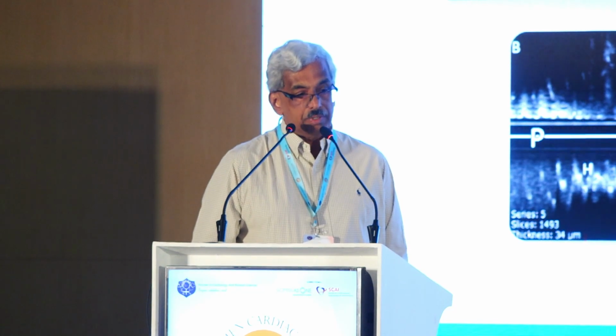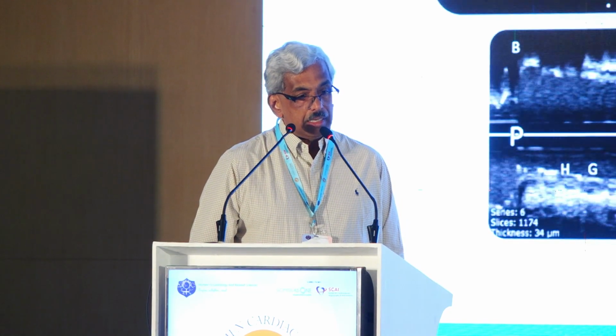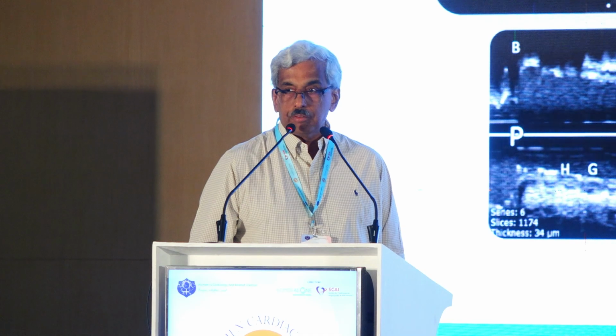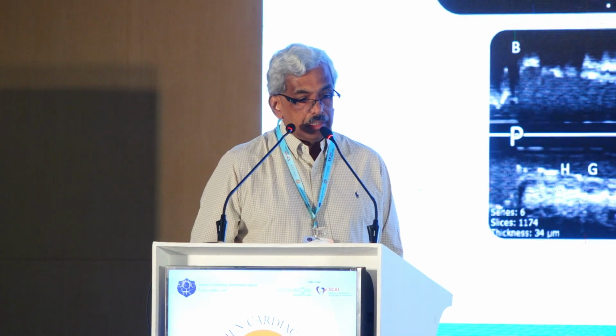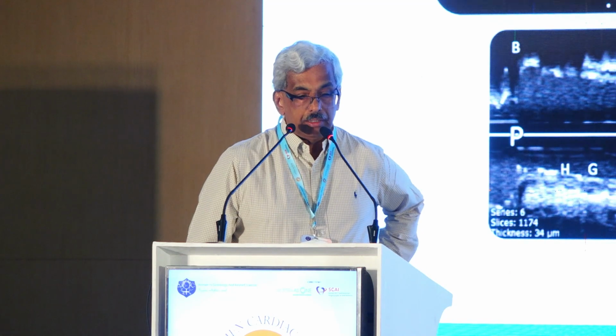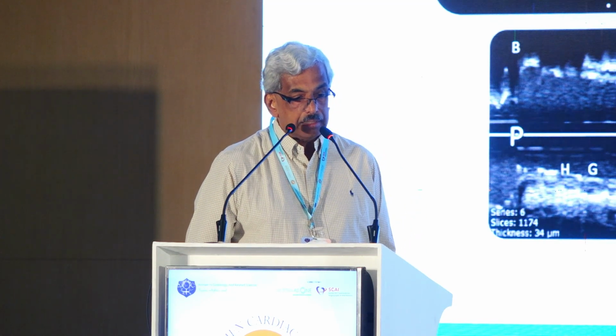These are the diameters we got post-procedure, and you have a pullback from both IVUS, from the circumflex and LAD, looking good. I don't think there's a problem. You got a distal stent diameter of 3.8, the left main at 4.75 from the circ, and the mean stent area is left main 15, LAD is 10, circumflex is 9, and the POC is 10. Excellent data, excellent result. So why do we need anything further?